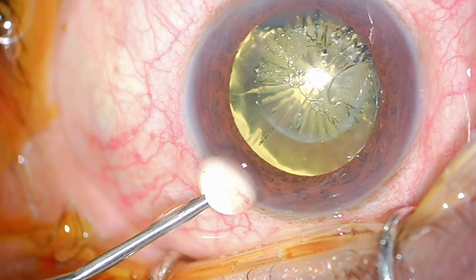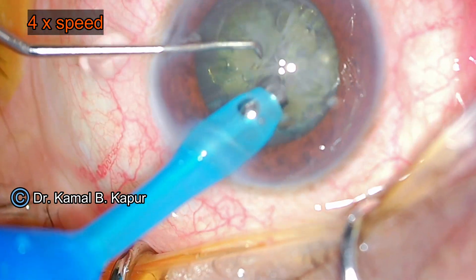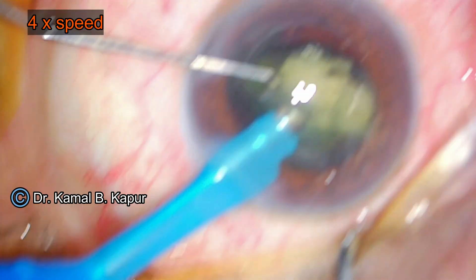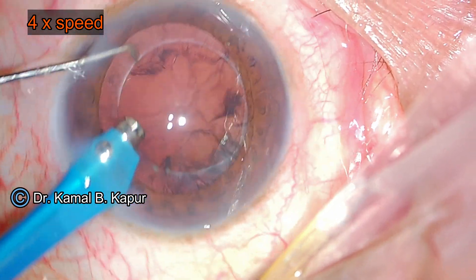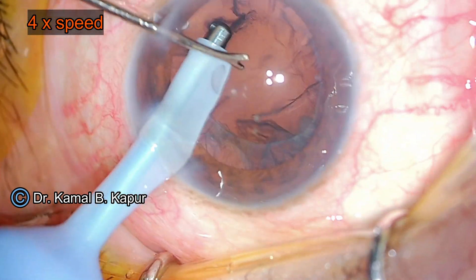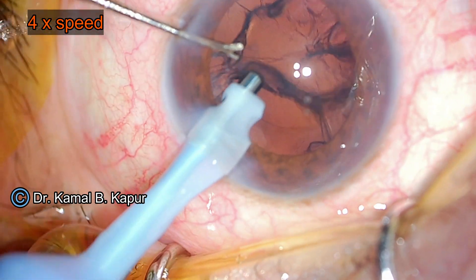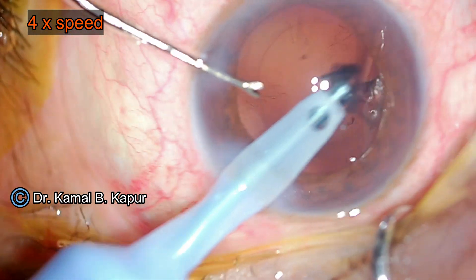We will demonstrate the use of the Femtis bag-in-the-IOL concept, showing the Femtis-IOL implantation with the toric Femtis-IOL implant, coupled with the IntelliAxis, which is only available with the AI-based Lenzar femtolaser cataract surgery. We will be fast-forwarding the cataract surgery here and slow down to the relevant speed when we reach the relevant parts of the surgery.